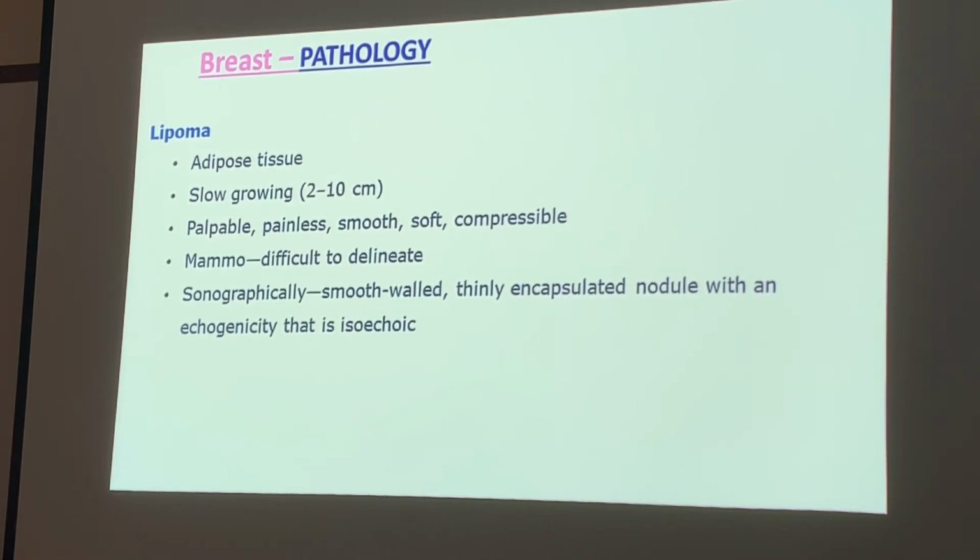So that's why I say anything. I don't care if it's massive, I don't care if it's a cyst, thyroid, testicle, no matter where it is, renal, you only measure the largest 3. So don't be overwhelmed by, oh my gosh, it has so much stuff going on, I can't make it out.